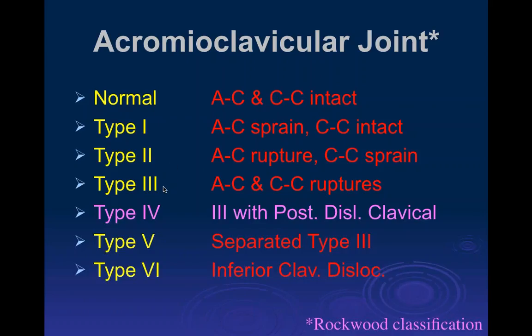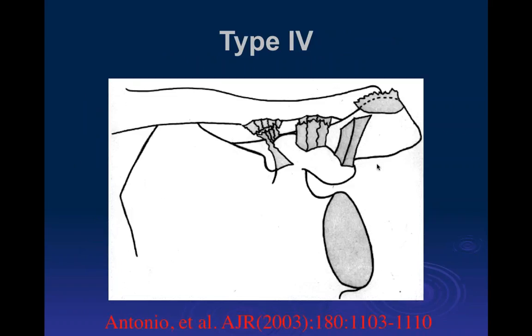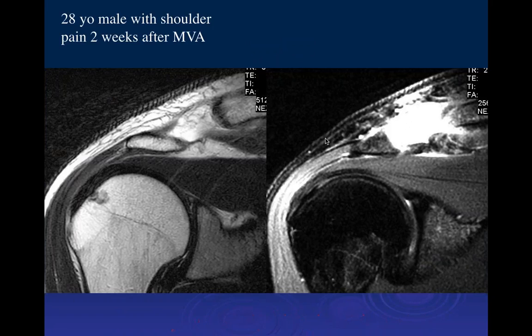Type 4 is like Type 3 but with a posterior dislocation of the clavicle. Instead of being anterior, the clavicle is posteriorly displaced with respect to the acromion process. In this 28-year-old male with shoulder pain two weeks after a motor vehicle accident, we have a coronal T2 and PD fat-sat image of the shoulder.